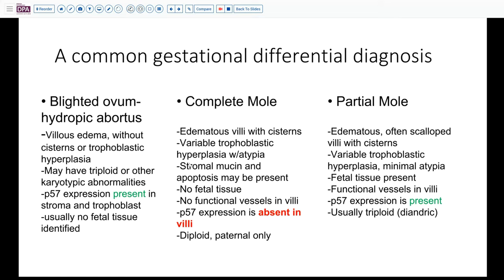The apoptotic changes, if you find them, can be present in the stroma in a complete mole, but are not absolute. Fetal tissue may be seen in a blighted ovum and may also be present in a partial mole. The vascular findings — usually because there's a fetus and some circulation — the vessels are functional in a partial mole, as they might be in a blighted ovum.